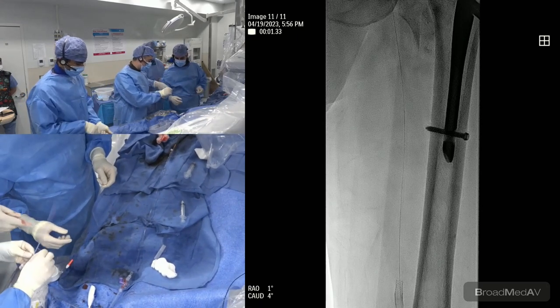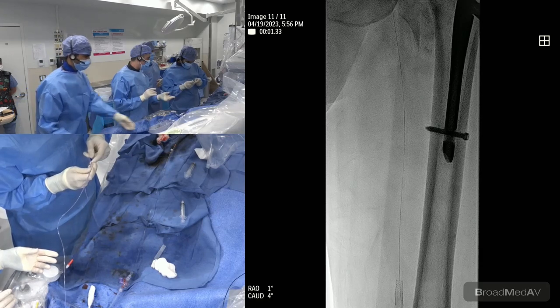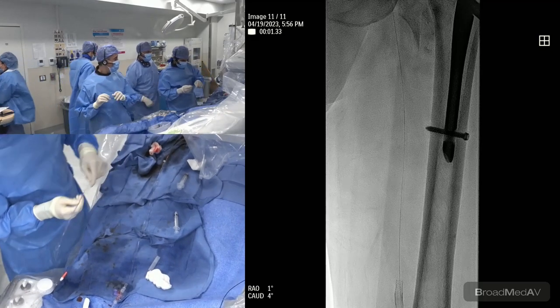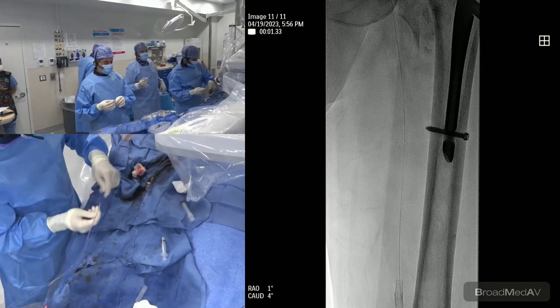All right. Like Pika said, minimal manipulation. Leave that on. You can take it off as it goes in. That's why they put that. That one came off on the last one. This one, it won't come off. Okay. So Raman can do the peel away as he goes in.